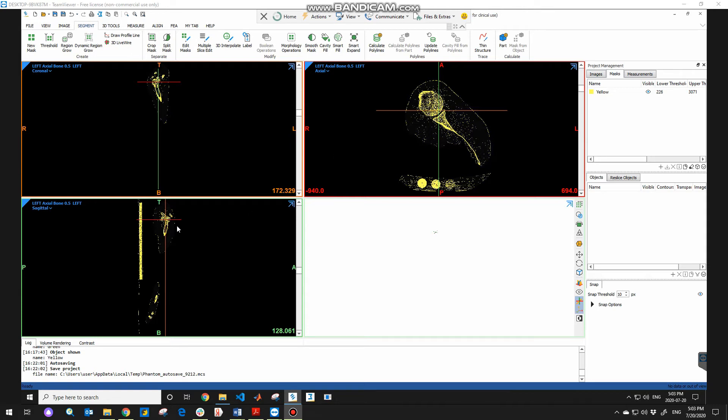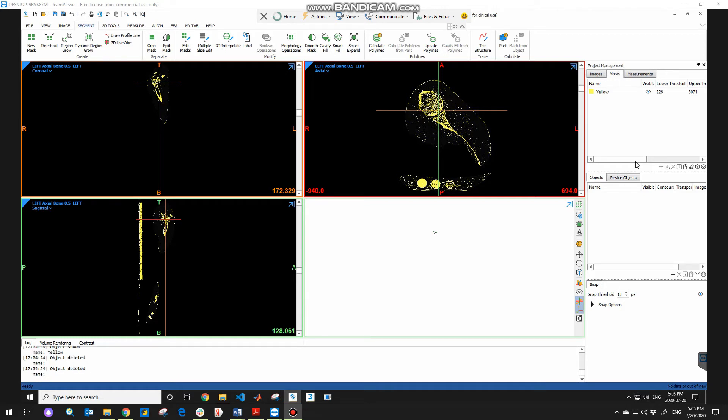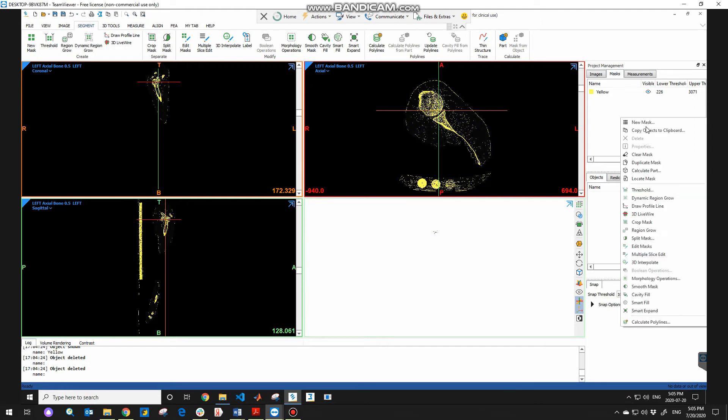The first thing you need to do is going to the mask section under the project management tab. Here, project manager tab and mask section to be able to mask. In this area, hit the right click and choose new mask to create new mask by defining upper and lower threshold ranges.